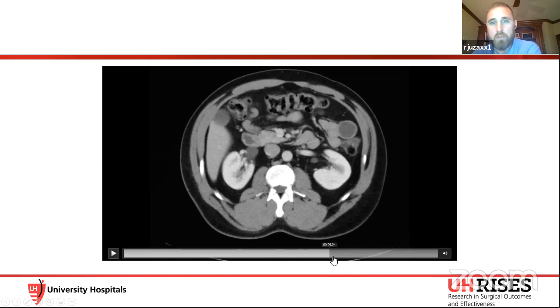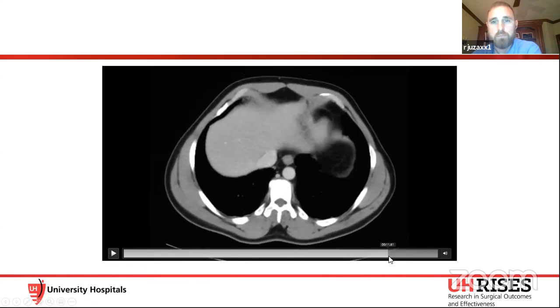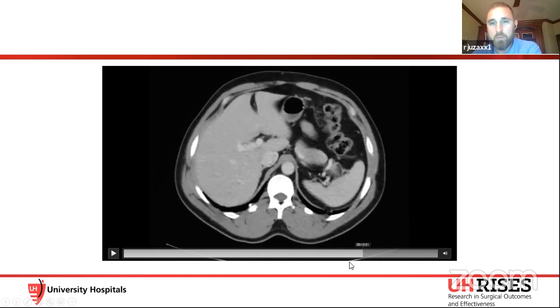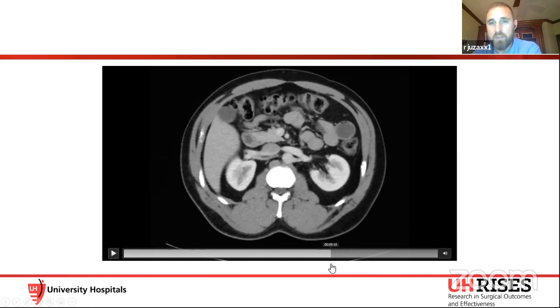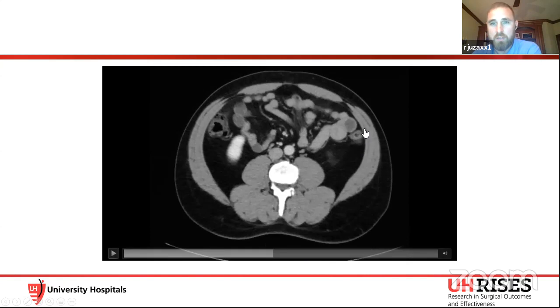And those go all the way up and join with the internal thoracic artery. The lateral vessels, the musculophrenic and the deep circumflex, are more difficult to see. They run in the intermuscular plane. And as far as this CT goes, I do not have good imaging of those, but you can understand that they run between transversus, internal, and external oblique. They run in this plane out here.